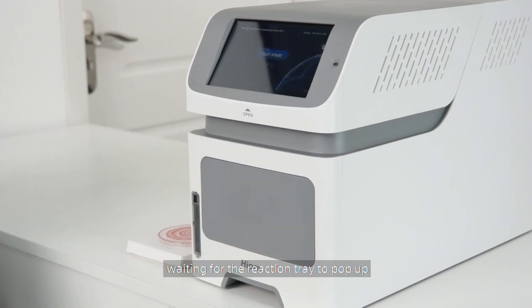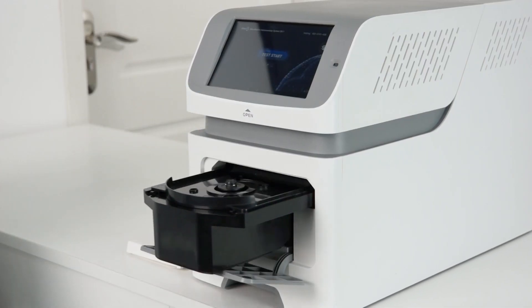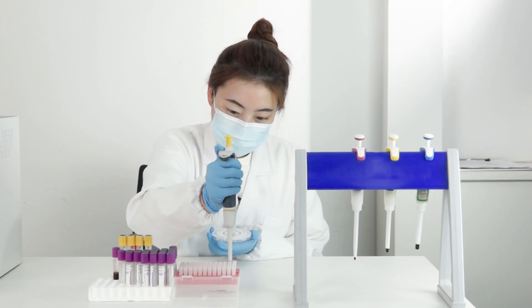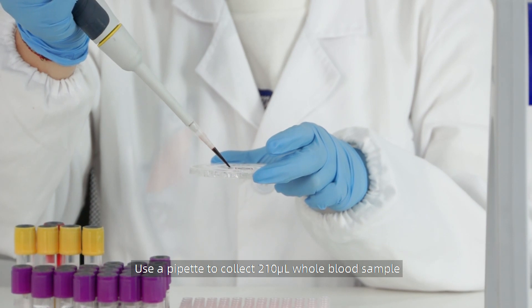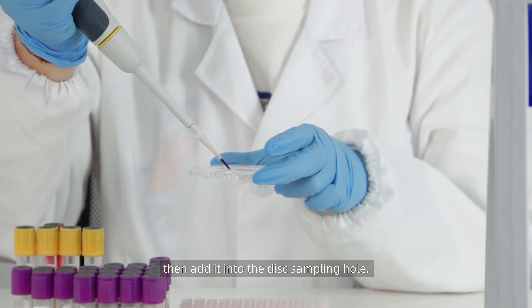Wait for the reaction tray to pop up. Use a pipette to collect 210 microlitre whole blood sample, then add it into the disc sampling hole.